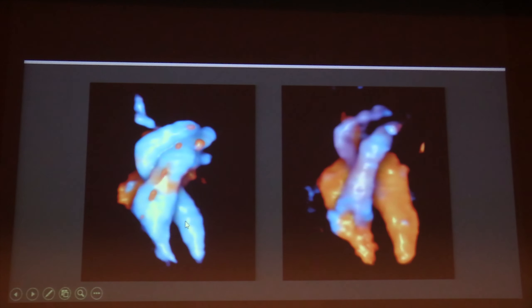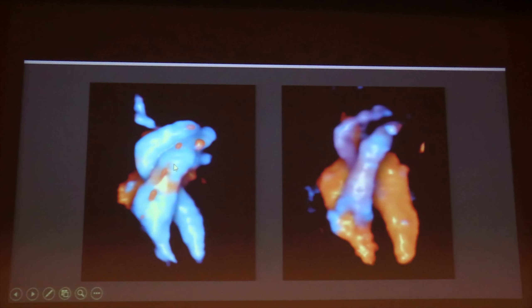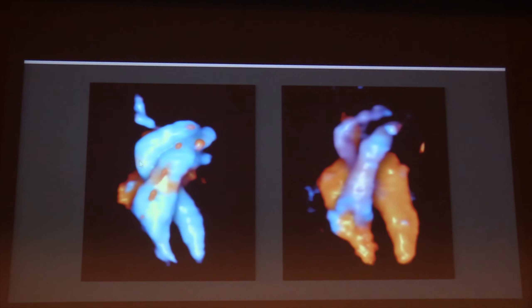This is the right side, this is the left side. You can see very easily that during systole, this is the left ventricle, and you can see that the aorta first is below the pulmonary artery, then it goes to the right, and then it turns to the left. This is a third trimester depiction, and you can see that the pulmonary artery is wider than the aorta.